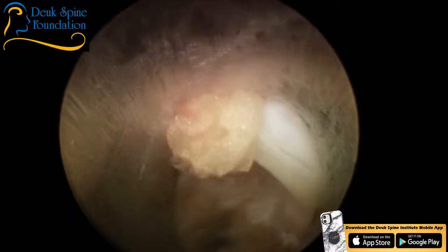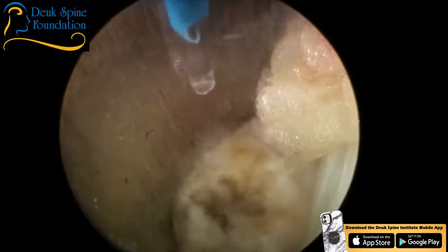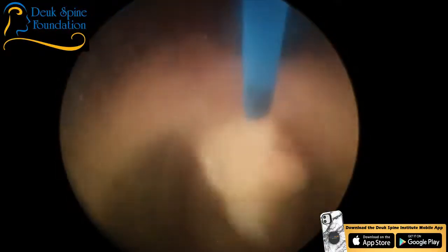Right, there it is. There's the nerve root. You see that? The white right there? That's the nerve root. And that's a little bit of fat around the nerve root in the foramen. So the nerve root's intact. We didn't damage it or anything. There's the herniation. I could zap this fat out of here.